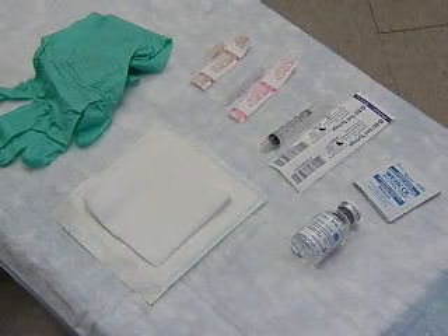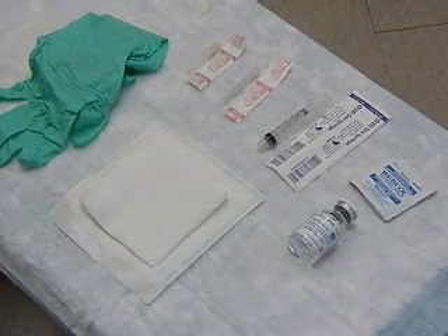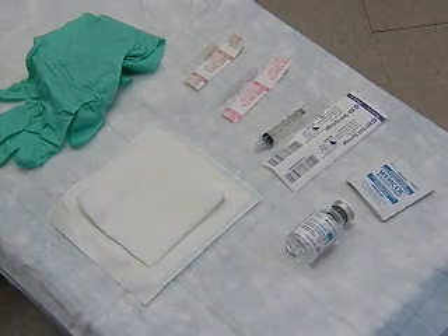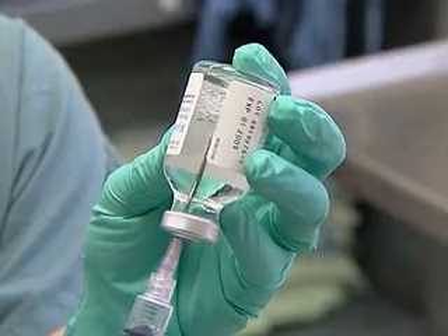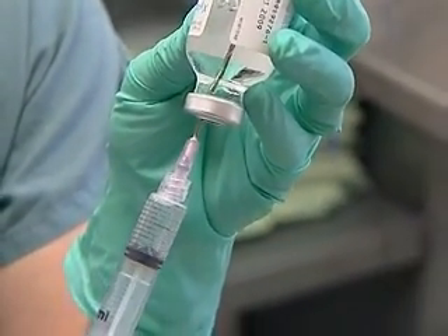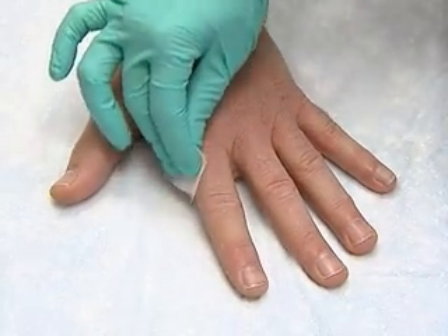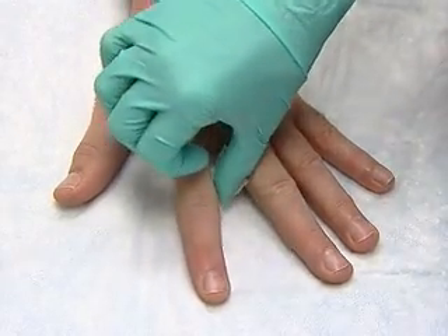The digital block is a simple anesthesia procedure for fingers or toes. You'll need a short 25-gauge needle and local anesthetic without epi. Observing universal precautions, as always, we prepare the anesthetic. The patient's hand is placed firmly on the table, fingers spread, as we disinfect with an antiseptic wipe.